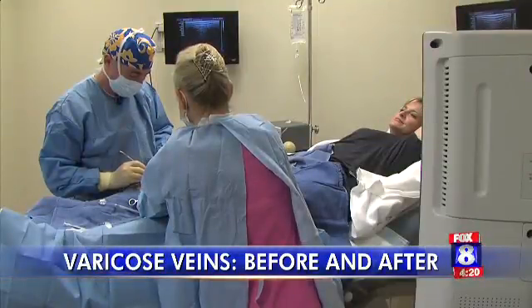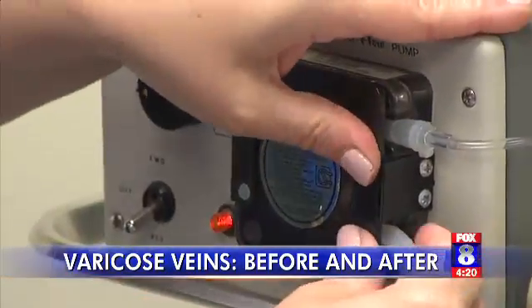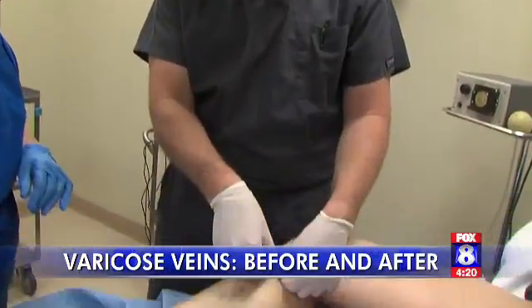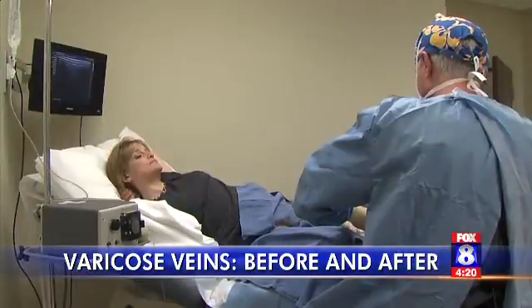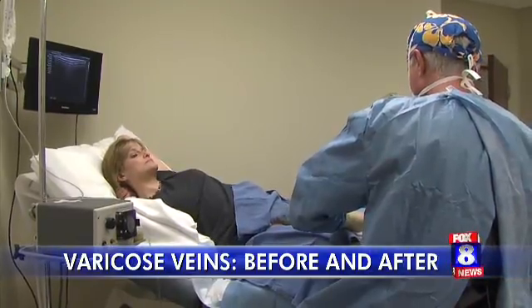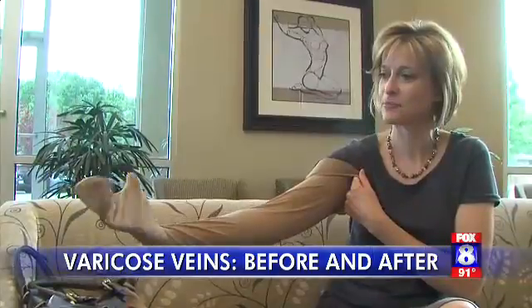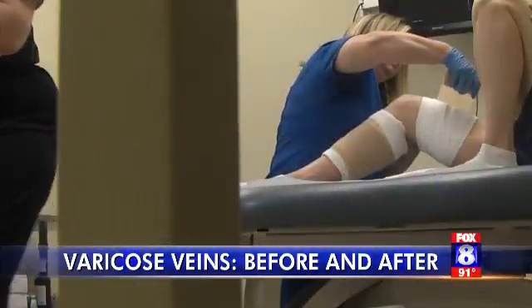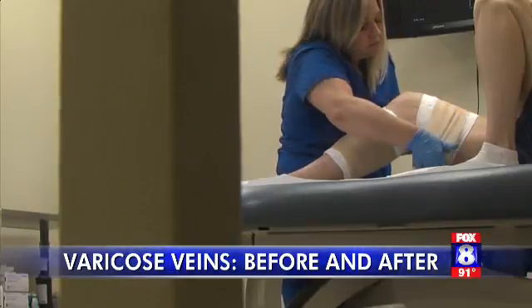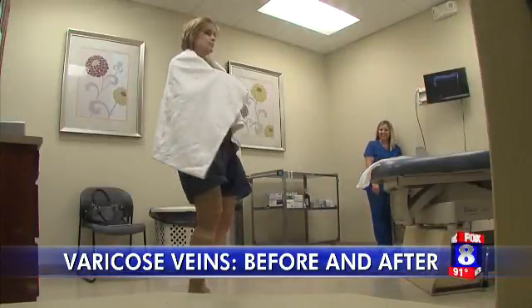For my bumpy calf, he does a more traditional procedure to remove the problem veins. There is some tugging and pulling, but no pain. The great part is, once these veins are gone, they're history. When we're done, all I have are some little holes that look like mosquito bites. We'll have you wear the stockings day and night — you're going to sleep with them on, you're going to shower with them on. That's only for a few days, and the stockings are surprisingly comfortable. Those stockings stay on during the day for the following week, and the reduced pain and pressure was noticeable almost immediately.